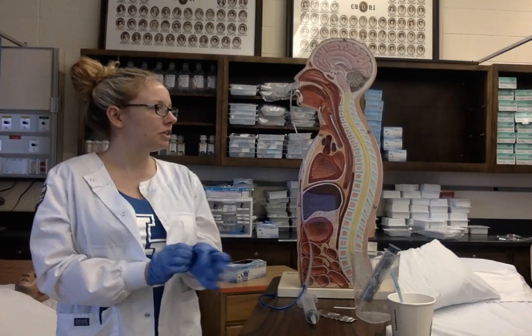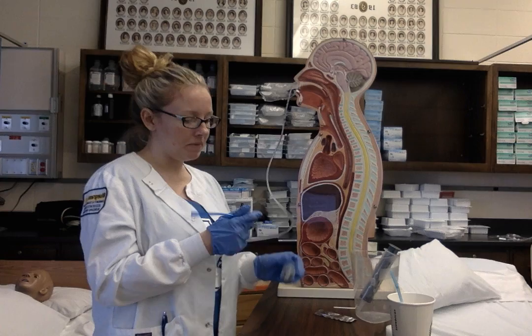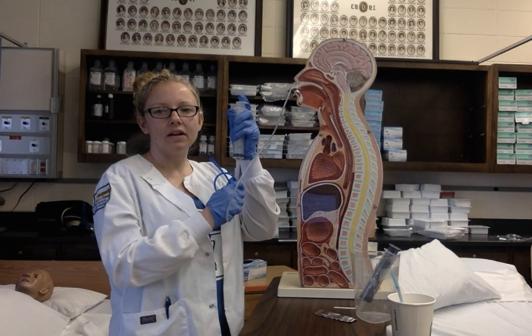I'm going to check the tube's placement and clamp the tube. I'm going to draw up 30 mLs of normal saline and insert it into the tube. I'm going to unclamp the tube and insert it slowly and evenly. Then I'm going to pull back on the syringe and withdraw the fluid.